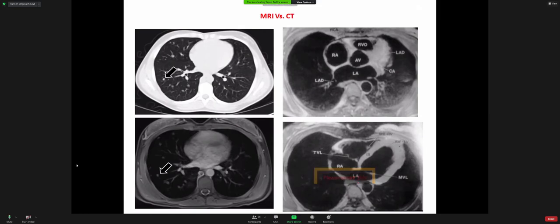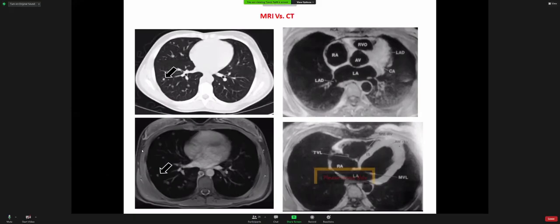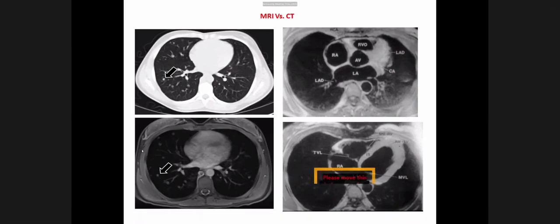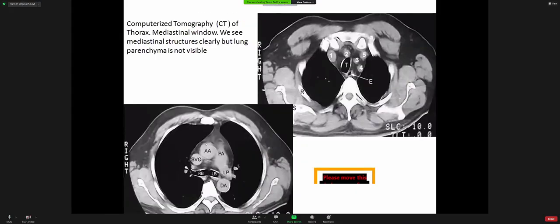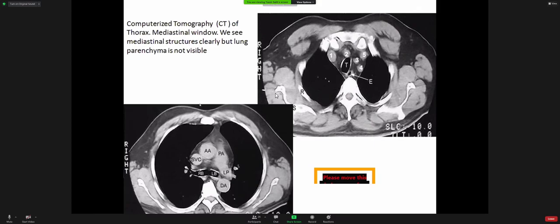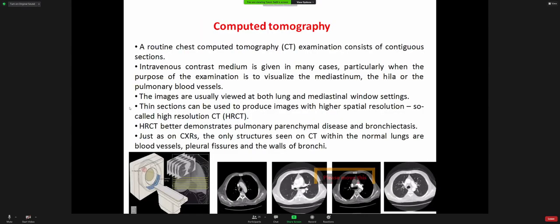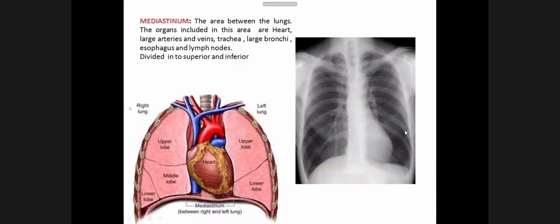Okay, doctor. Another question. Other than knowing the modality and the view, do we have to know everything else, like we just saw with the CT scan, the trachea, the left and right primary bronchus? Do we have to know their features as well? Yes, trachea and right and left main bronchus and carina, and right and left lung. The structures related to the respiratory system only. This is on CT, but in plain X-ray, in addition to this, you have to know the right and left hemidiaphragm.